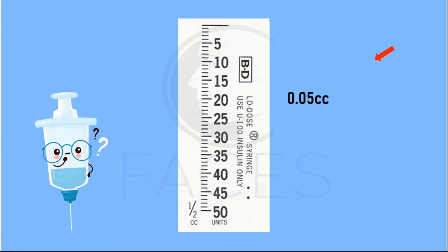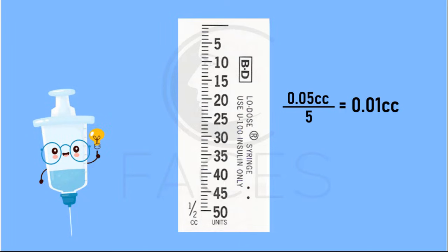As in every case, the numerator is the volume of increments designated by numbers, and the denominator is the number of lines between the numbered marks. The resulting quotient is 0.01 cc's. Every line on this syringe has a liquid volume of 0.01 cc's.